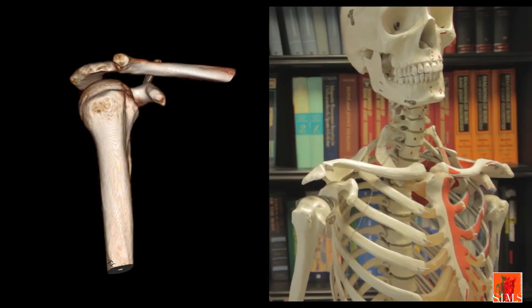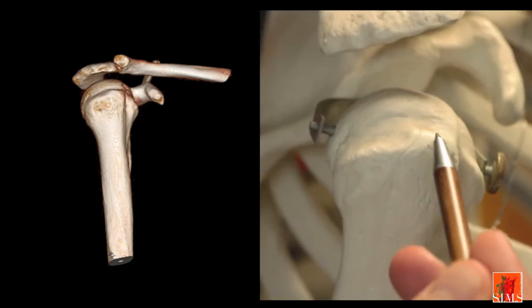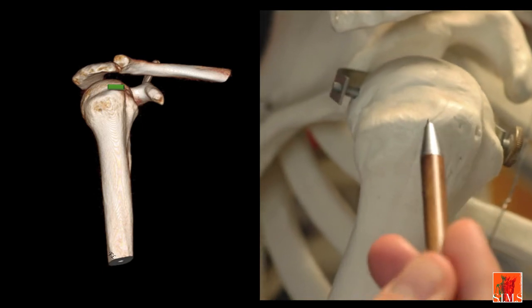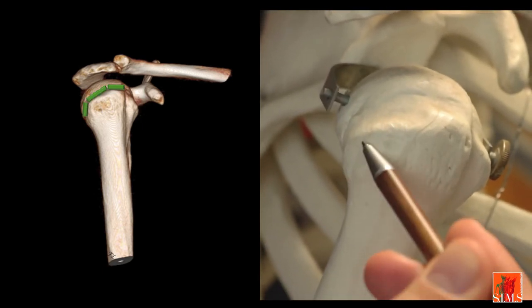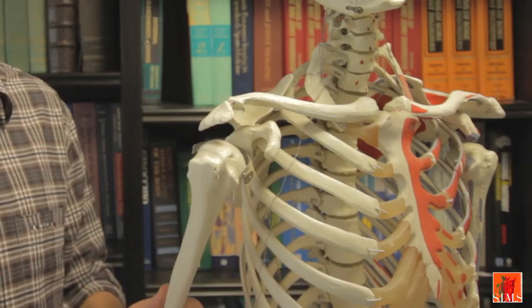The precise anatomy of the greater tubercle warrants a description. In fact, it has 3 insertion facets. The first is horizontal and receives the supraspinatus. The second is oblique and receives the infraspinatus. The third is vertical and more posterior and receives the teres minor.